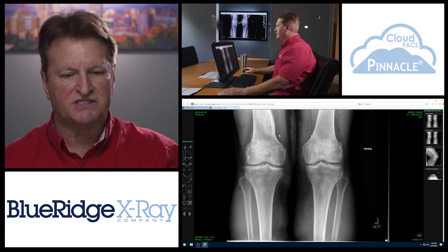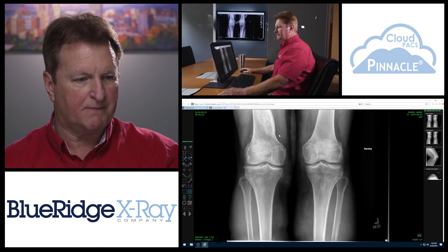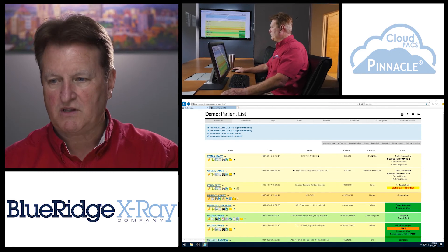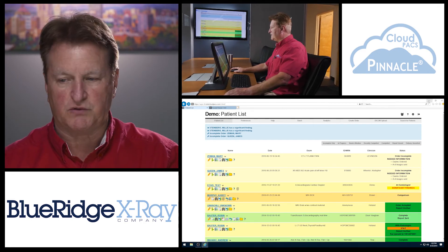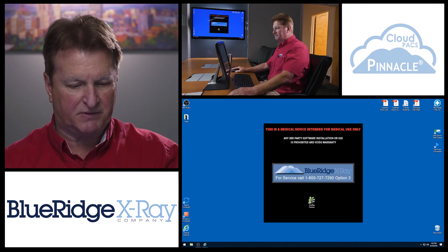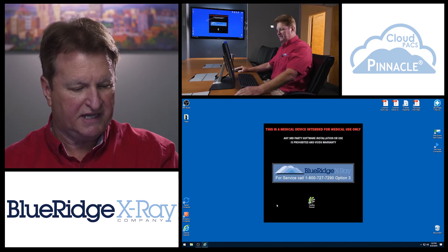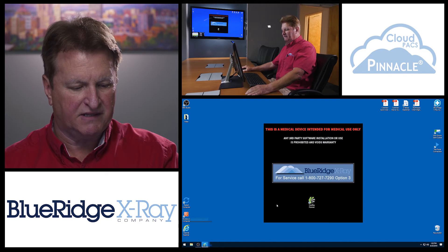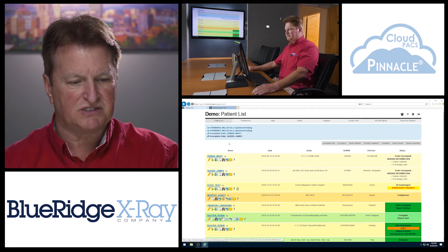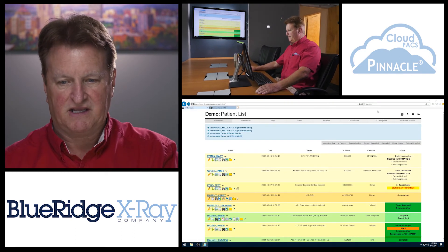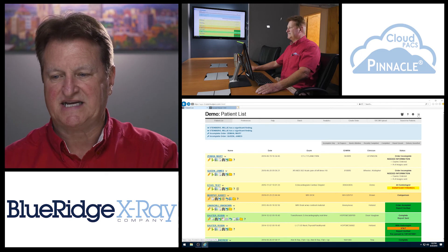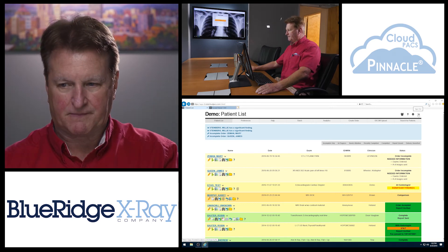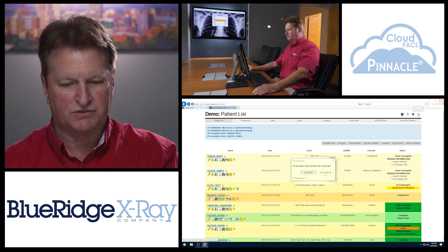The typical workflow is that the viewer is open. When the provider is finished viewing the patient's images, they simply minimize into the tray at the bottom. When they want to view images again, they open the study list, open the next study, and then close it when finished. At the end of the day, they would simply log out and close the program.